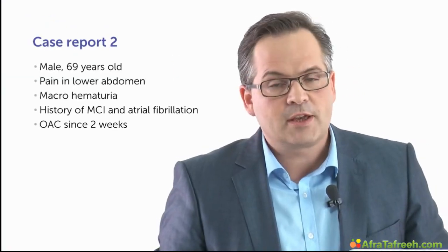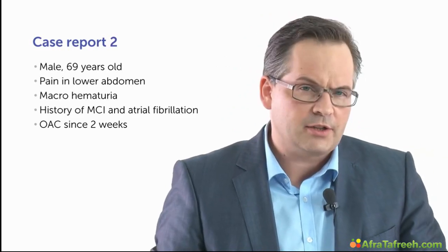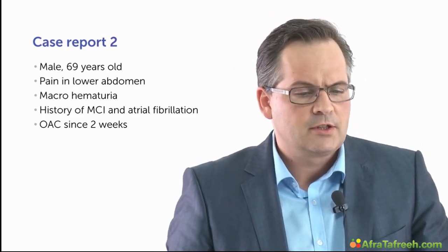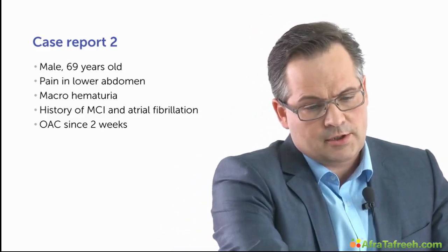We got another case of a patient with pain in the lower abdomen. Now, let's see what it is. I was on night shift again. A male patient came to our hospital and complained about pain in the lower abdomen. He had a medical history of a myocardial infarction 1 year ago, and 2 weeks ago he was diagnosed with atrial fibrillation and received oral anticoagulation.